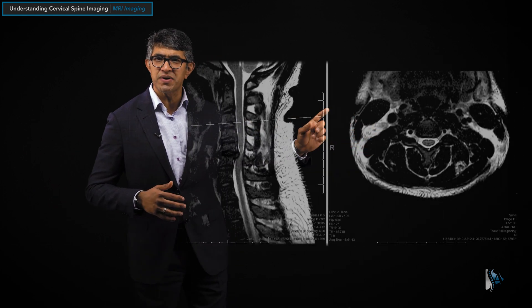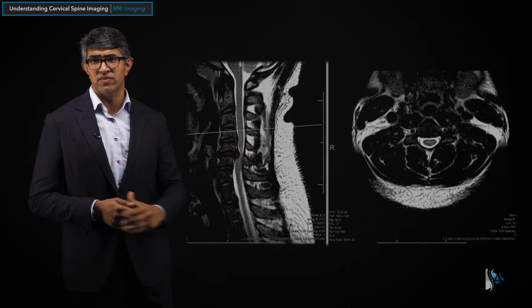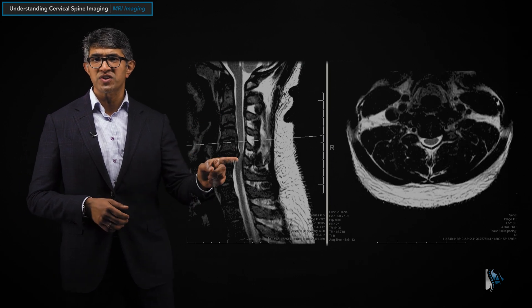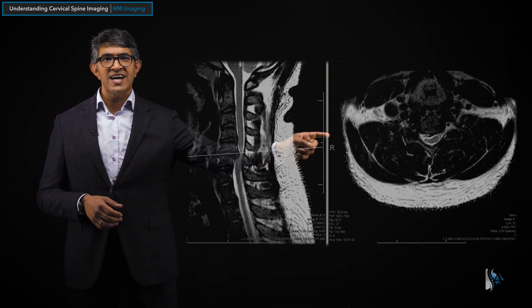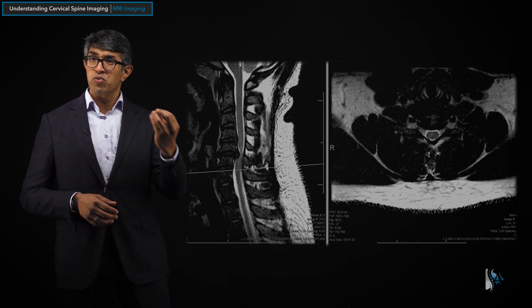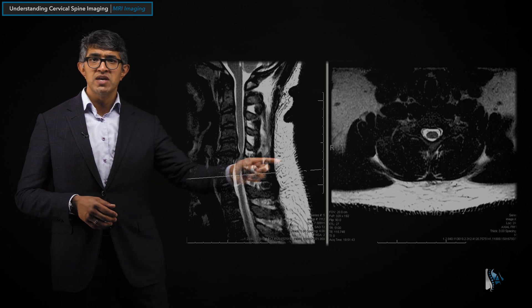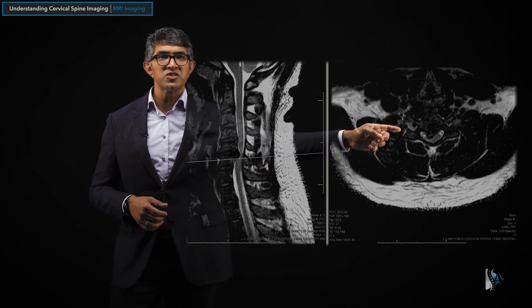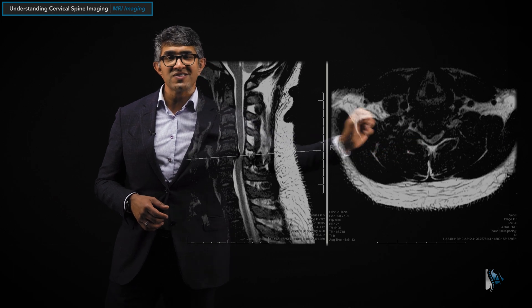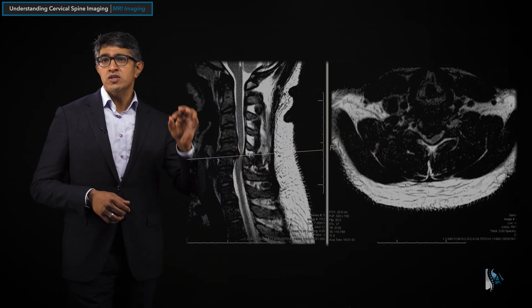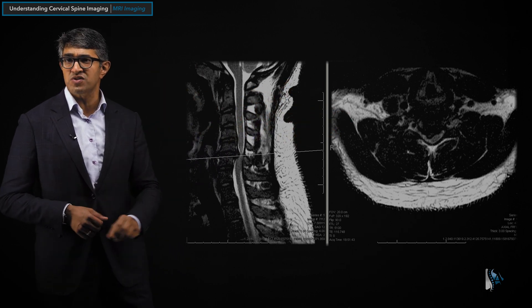Those are normal MRI images. But here's a patient I took care of — a very interesting young man who's a race car driver. You can see the sagittal T2 sequence with a fairly large disc herniation here. Coming through the axial sequence, you can see it over there. He has a fairly large disc herniation pressing on his spinal cord and pressing on the spinal nerve. You can see how the spinal cord looks pretty good, but at this spot he has a large disc herniation on the right side causing pressure on the spinal cord, which was causing him difficulty standing and walking.